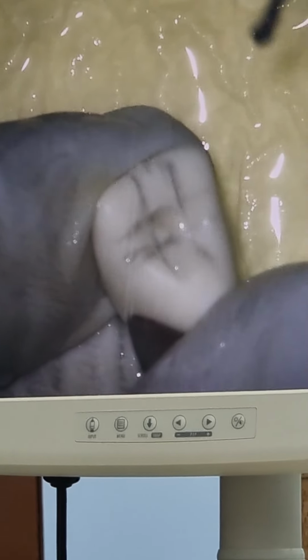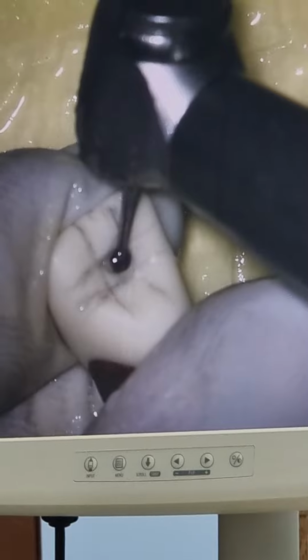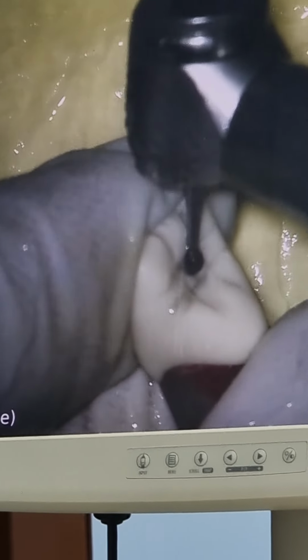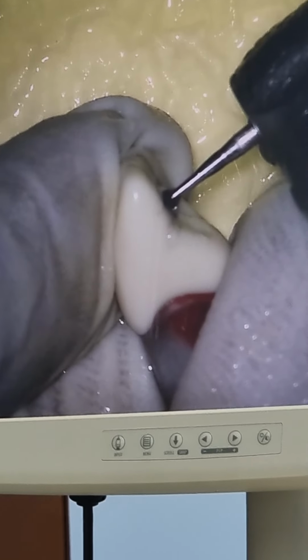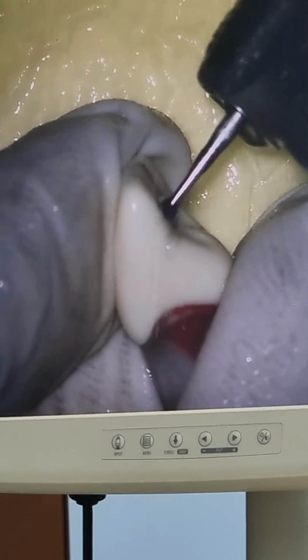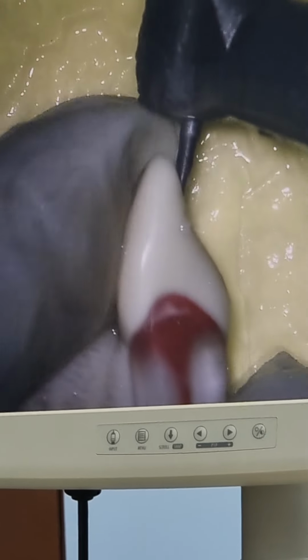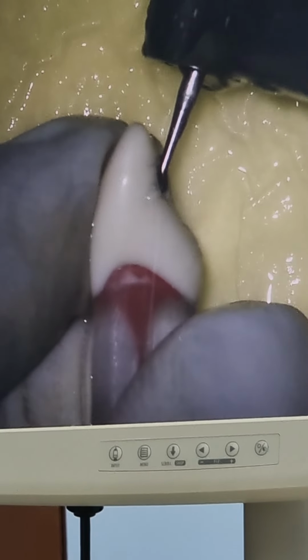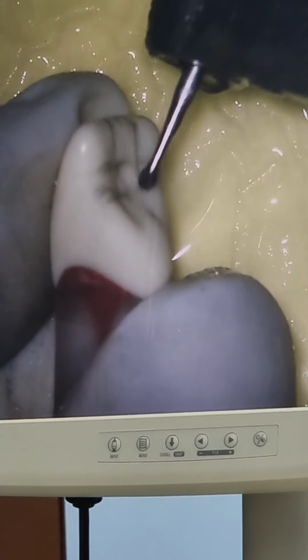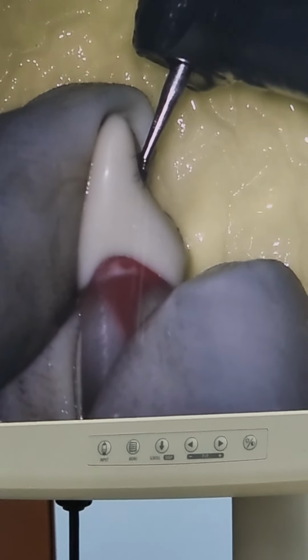Now once you go into the tooth 1 or 2 millimeters, you have support, like a base or a punch cut against which you can rest your bur. Then you move the bur from perpendicular to parallel to the long axis of the tooth. Parallel to the long axis doesn't mean straight. It should be parallel to the long axis, but give a slight lingual tilt to the bur.